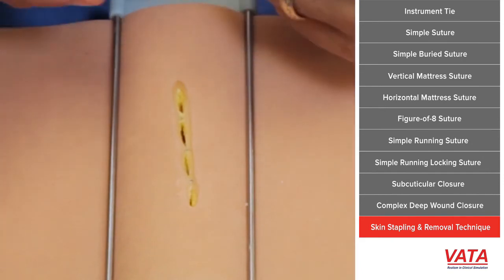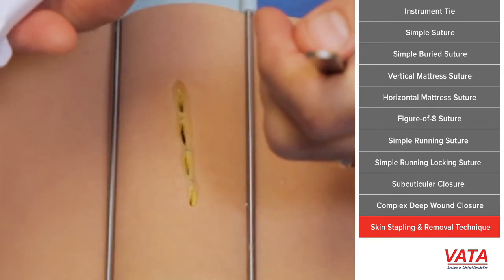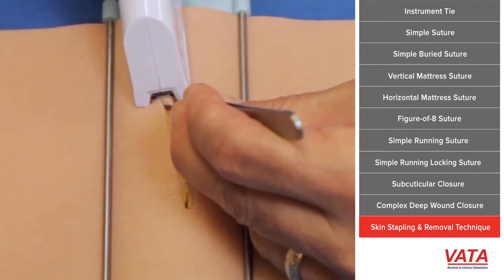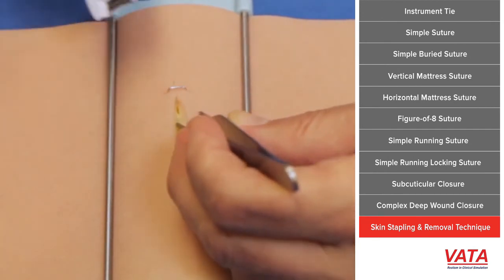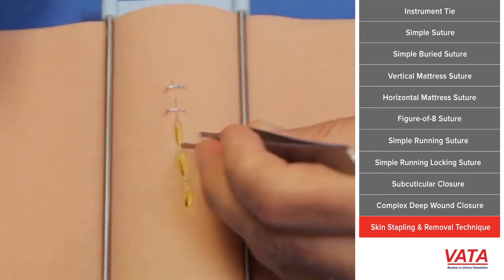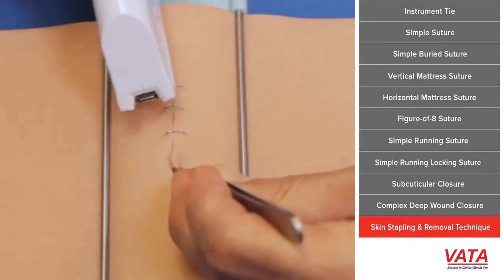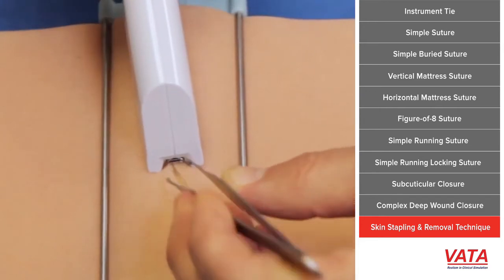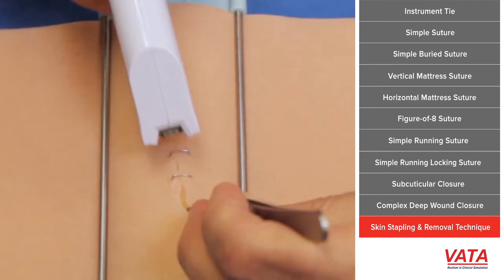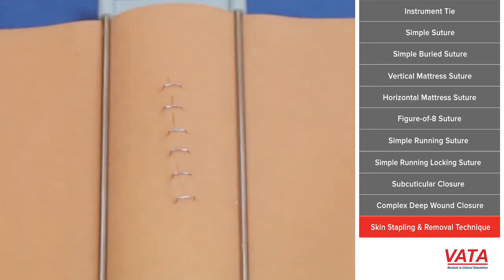Nag-malfunction. All right, let's try again. You have your thumb forceps to bring the skin together. You click. There you go. This requires your subcutaneous tissue to be apposed already. Remember, our wounds are closed in 3 layers: muscle, subcutaneous tissue, and the skin. So this requires your subcutaneous tissue to be apposed already. See? And it's good.